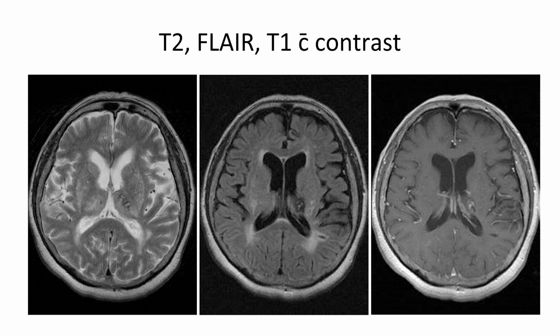And then on the right, we have a T1 image with contrast. You can tell this because the vessels are clearly lighting up with a little bit of contrast agent, and the central cerebral spinal fluid is dark. This one is actually a little tricky because this is actually a cavernous malformation. I remember on residency interviews being quizzed on stuff like this and miraculously getting it right. But this is all the same patient.